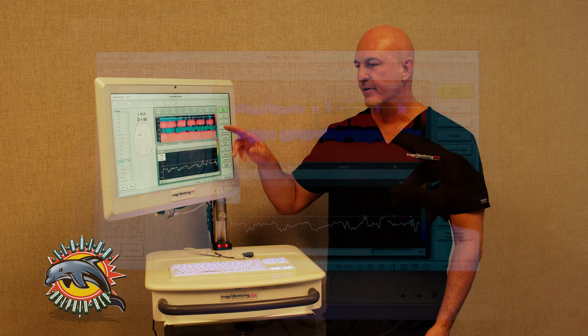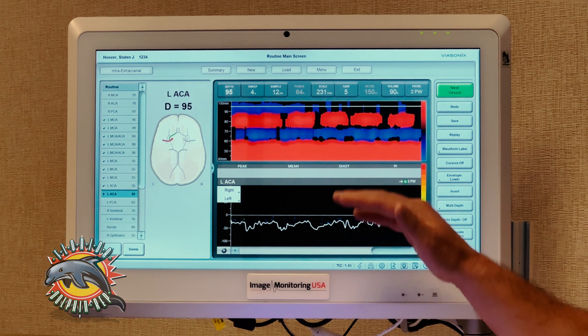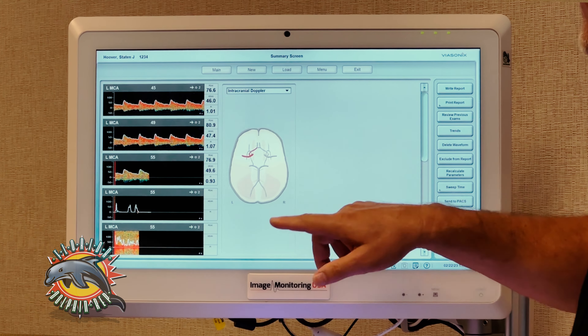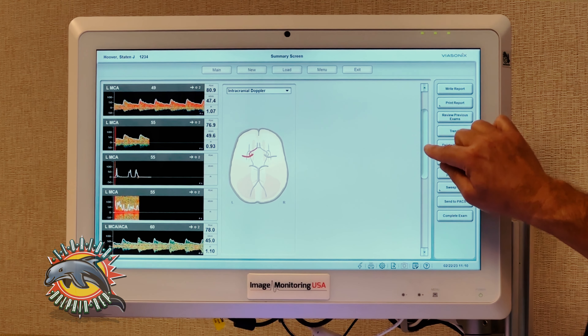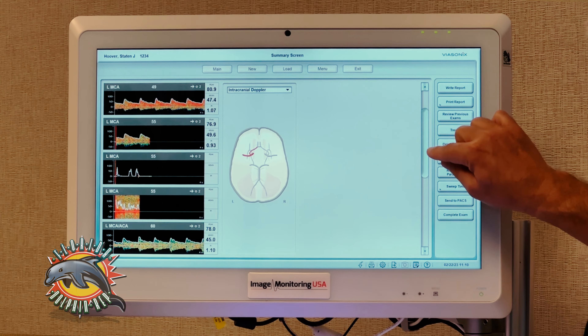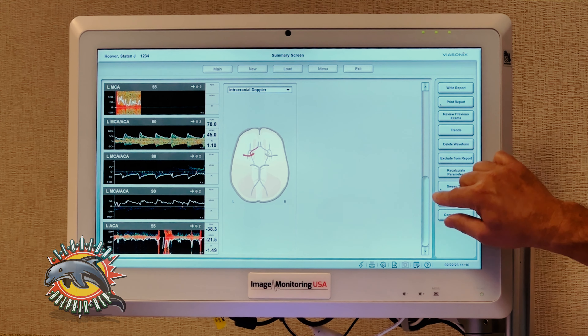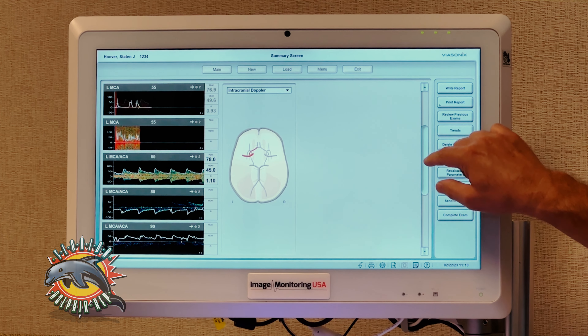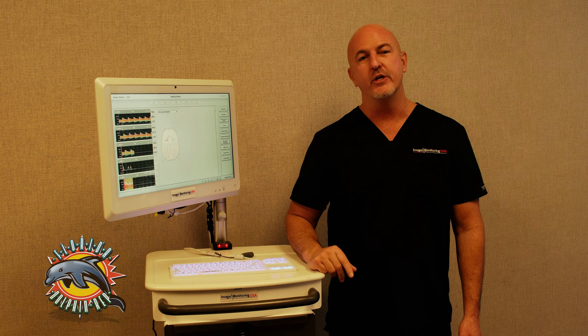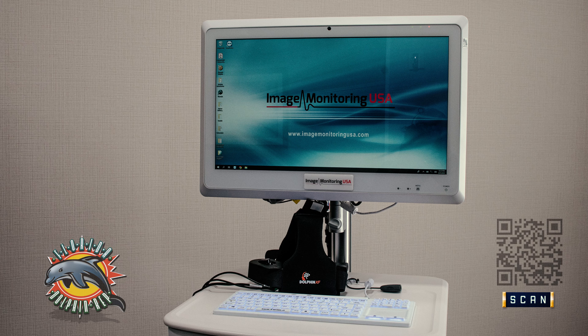The post-processing of the Dolphin IQ is second to none. Basically, from that one scan, you can actually fill your entire report. You go to summary, and you'll see all the different waveforms that you captured. Here you'll be able to manipulate the report, and you can extract and exclude the ones that you don't want.